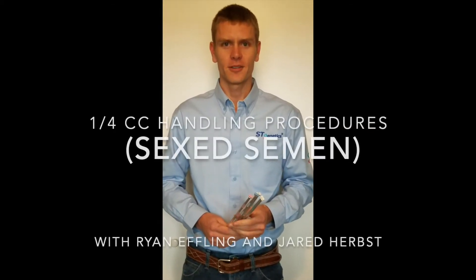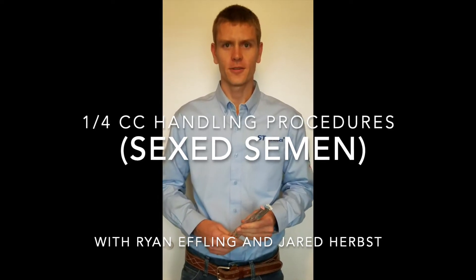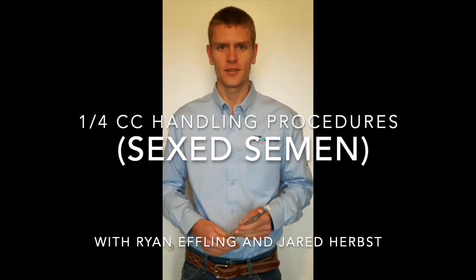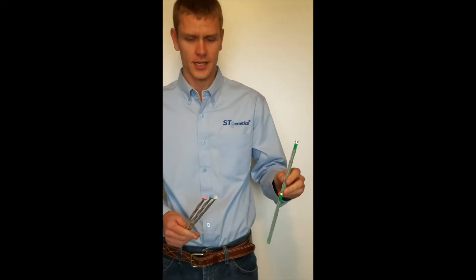Hey guys, it's Jared here with ST Genetics. Just wanted to hop on real quick and show you the difference between the old half cc straws and the new quarter cc straws. Most of you are very familiar with the half cc straws — they come in a little bigger cane.